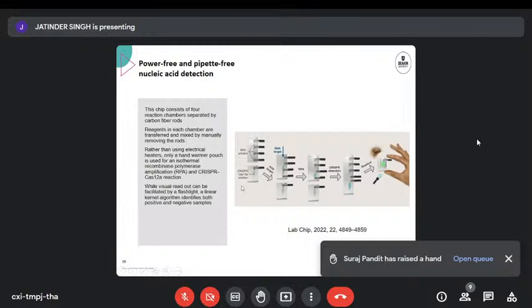And here we'll have a little slide on how we can use CRISPR chemistry for detection. CRISPR is very popular with molecular biologists because you can do gene editing with it. CRISPR is finding a completely new life in enabling sensitive detection and visual readouts. So we start off with doing RPA, CRISPR, and then a visual readout to detect the presence or absence of the amplification product.